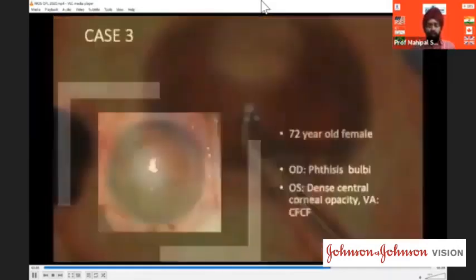The microscope is off, and you can see again. Look, can you see the ease with which one can do the phacoemulsification, and you can easily see the depth up to which you are going in these particular cases. And if you have to do it from the beginning to the end, the irrigation aspiration, the IOL implantation, it will always go in the bag, because the quality of the vision that you get along with the depth perception is very, very good, and that's the end of the surgery.